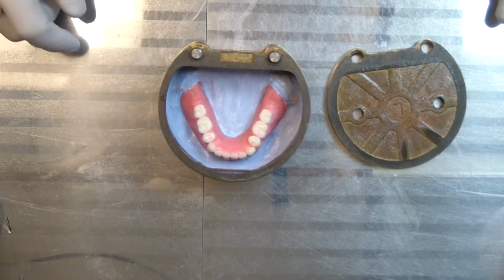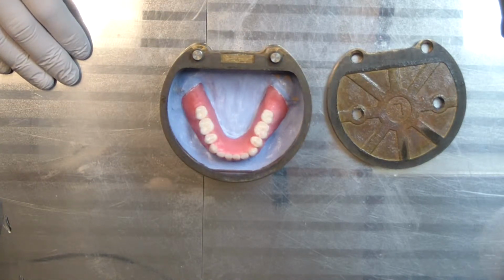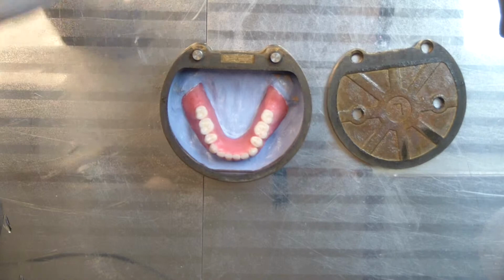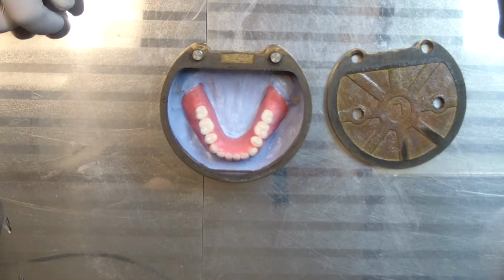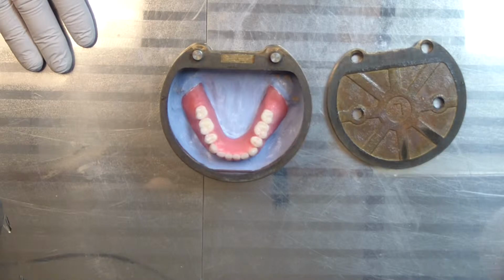I did obviously use my best flask for this, because I'm shooting a video and stuff. But a good way to keep them clean, what I generally do, I use the walnut shell blaster that you use to blast out the stone from the dentures. I use them just to clean these flasks. They work really nice for me, and I haven't had any issues. So from this point, you're ready to do your second pour.